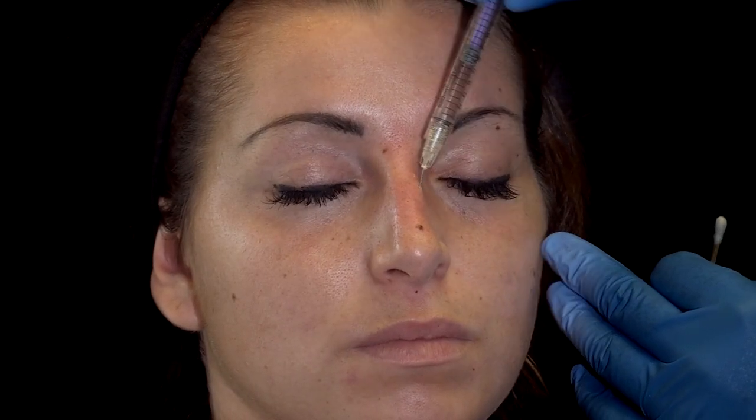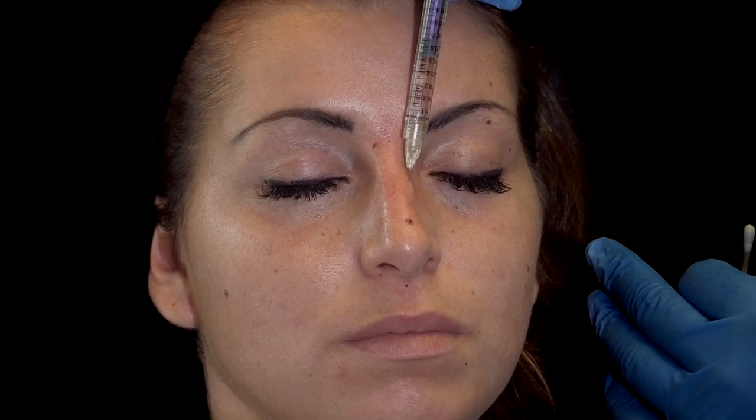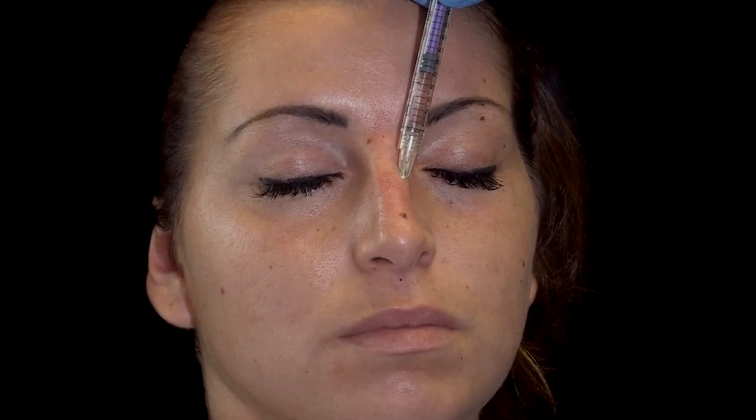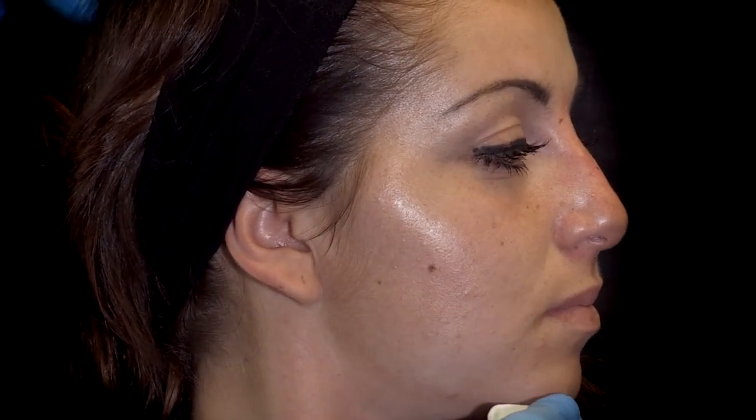To correct the concavity on the left side, we use a lateral injection, more superficial, subdermal, to recreate the aesthetic line on the left side, and you see easily on the right side the projection. That's the immediate final result with a good correction of the hump and a good tip projection.